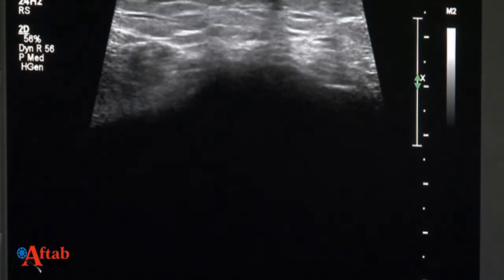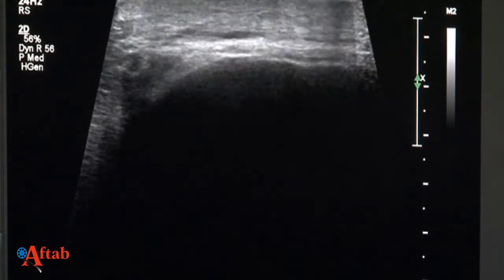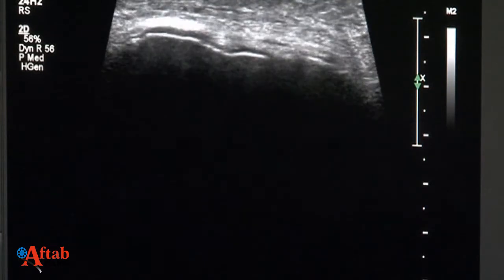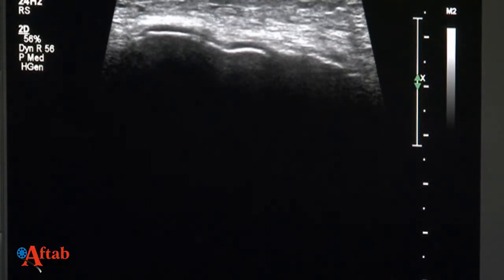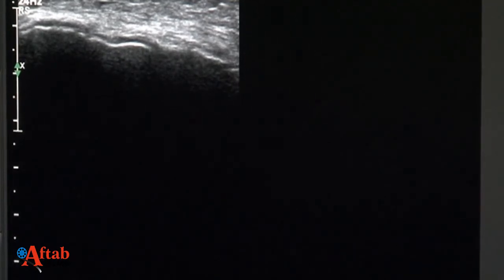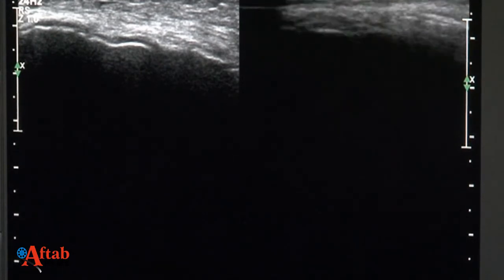And as we go on the medial side, all the way to the joint line, if you remember, we were talking about whether there is a loss of cartilage on the medial side. As you can see here, that's the joint line that we're seeing of the symptomatic side. I'm again making it dual for you. I'm so sorry, dual. Right, so I'm going to freeze this joint line for you here, and I'm going to go on the asymptomatic side again for you. And this is the joint line of the asymptomatic side.